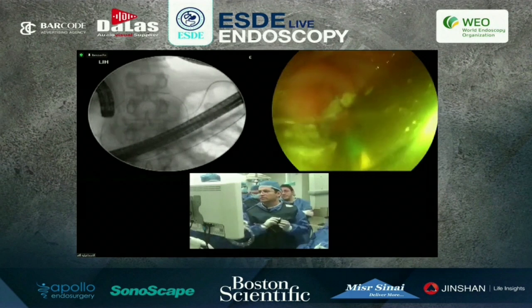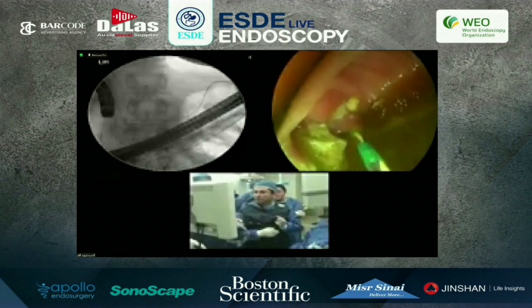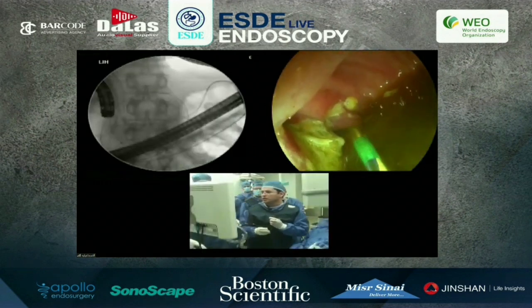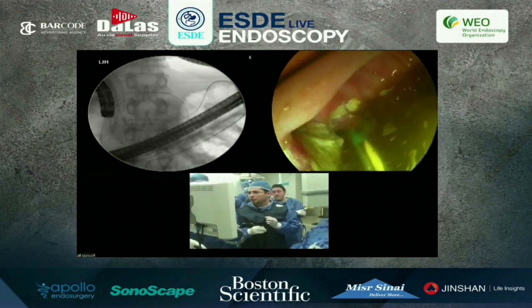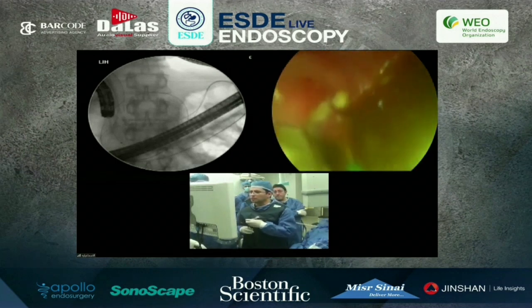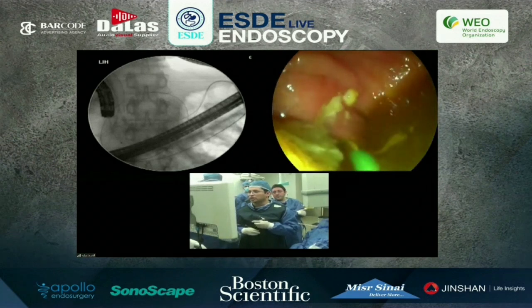We have today a 55-year-old male patient with cancer in the head of the pancreas, diagnosed with EUS FNA-guided histopathology to be adenocarcinoma causing double obstruction, periduodenal. ERCP with biliary stenting was done yesterday, and today we will insert a duodenal stent for gastric outlet obstruction.